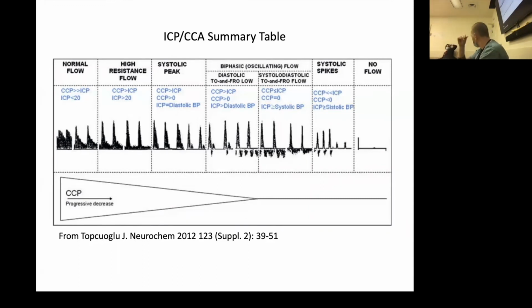So there's that meta-analysis showing the different techniques and their sensitivity for ICP. First of all, it showed that clinical exam was awful, and then it showed that CT head was awful. And then it showed that TCD sensitivity was somewhere around 70%, right? And optic nerve sheath diameter as well, though there are difficulties with the characteristics of the studies.